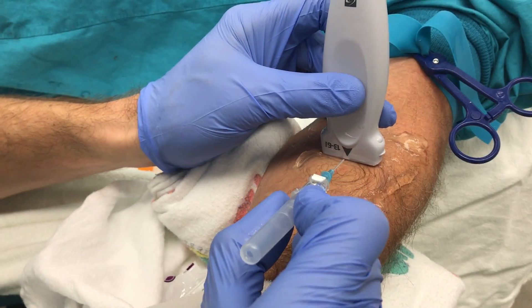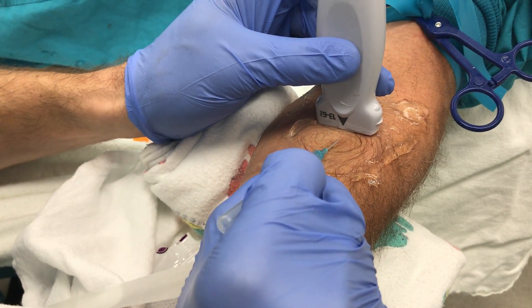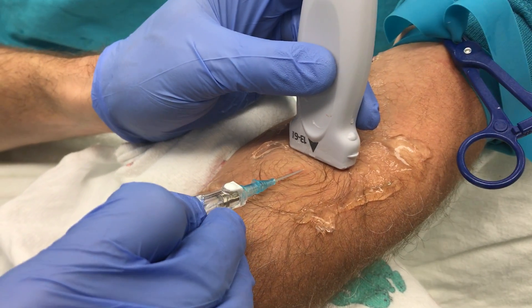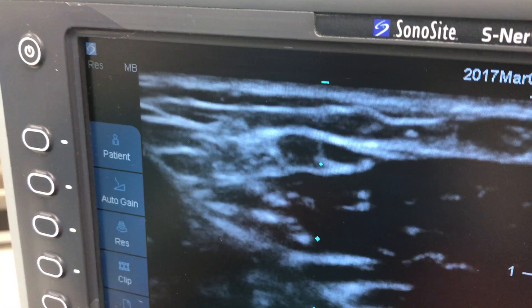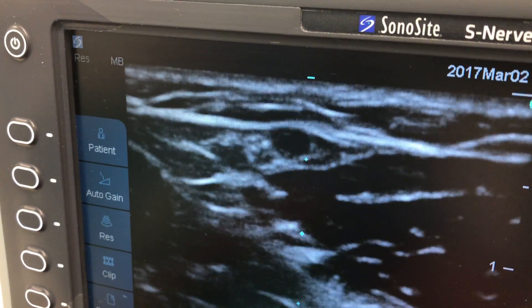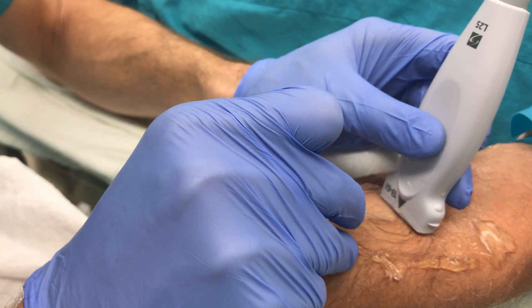I'm going to look at the probe and the needle, insert the needle into the skin, and then angle the probe towards the needle, sliding the probe back up towards the needle until I find the very tip of the needle. The first part of the needle is going to appear on the screen — you can see it appearing right at the top of the screen there — but it's not completely in line with the vessel, so I'm going to come back a little bit and move my insertion point slightly.